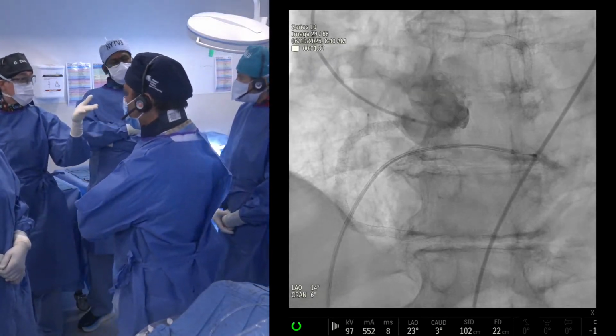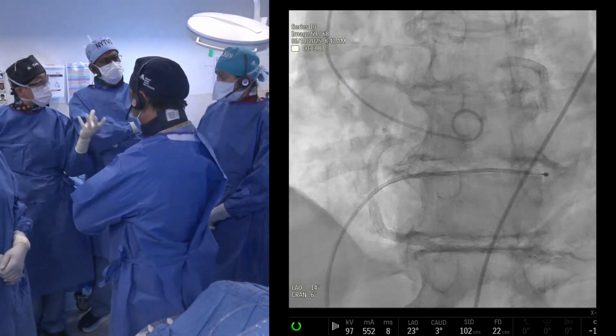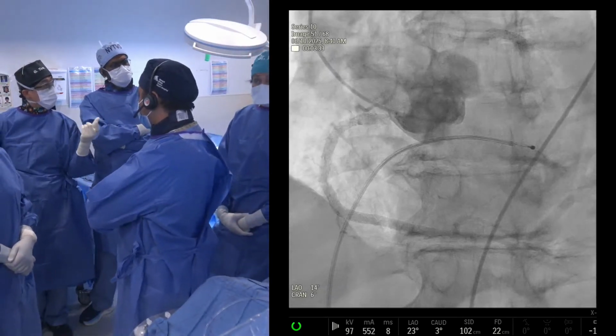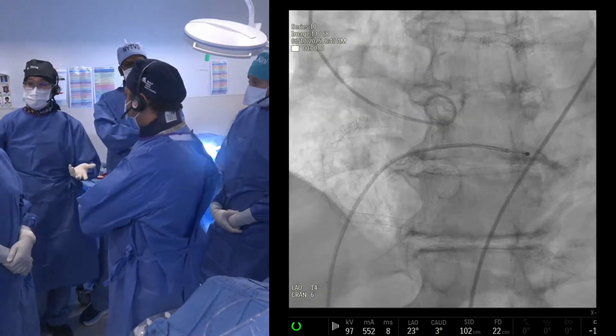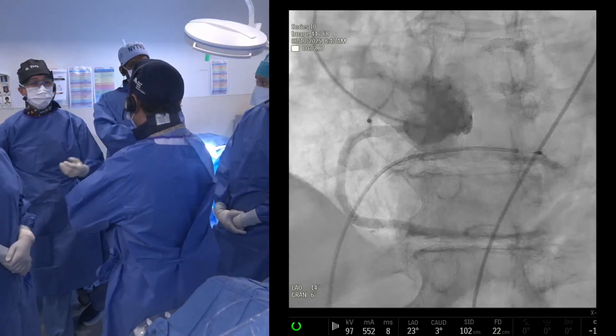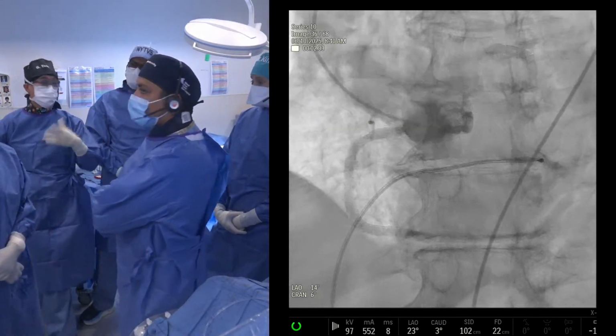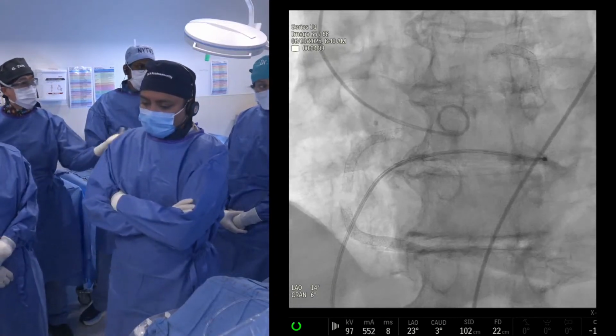I agree with you. 26 balloon expandable valve will be the right choice, but nominal will be a little bit risky because of all this calcium in the base. I'm saying, you would take a little bit of volume out, but then the concern will be under expansion and HALT and other things that we might have seen before. So again, there's no perfect solution. That's why we picked this case for discussion, and this is a very good discussion.